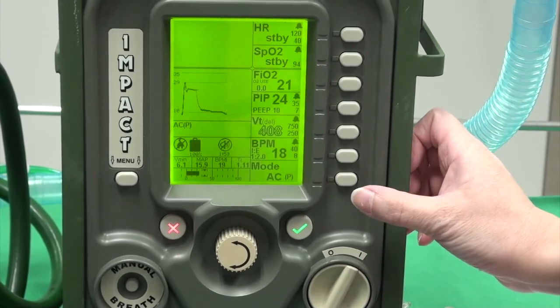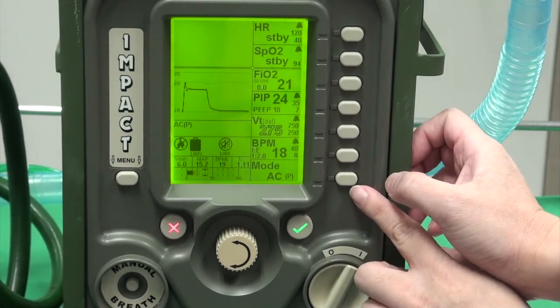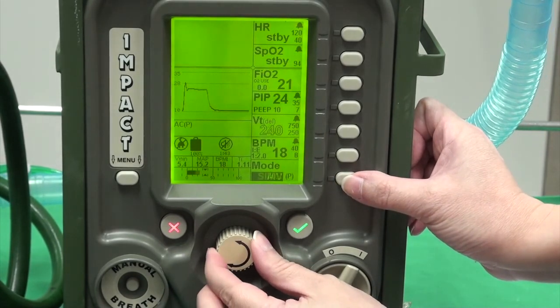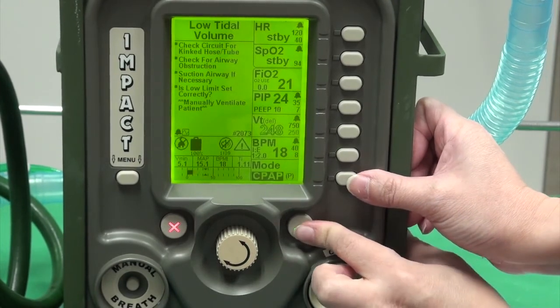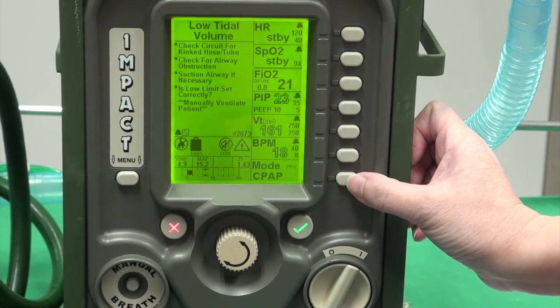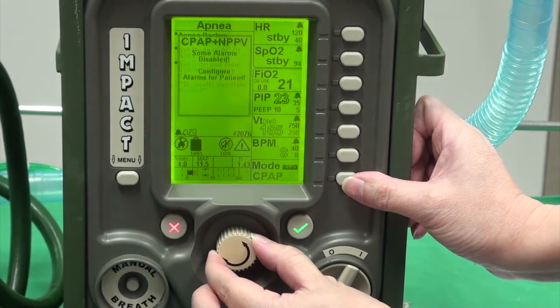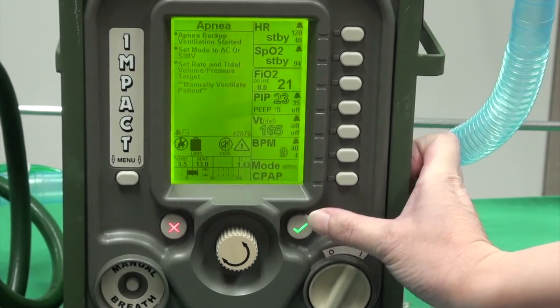To change to the NIV mode, go to the button next to the mode. Press it and change it using the knob here to CPAP and press the tick. Again, toggle on the same button to the PPV and change it to NPPV. Select it.